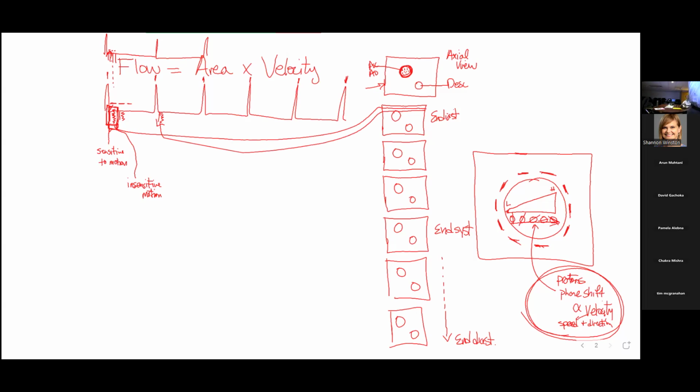The same principle, you know, to get the next frame, this comes over here. If we have another pair here, right? That goes here. So we're using the same principle that we used to make the cine images, but to make these velocity maps, in general, they're going to have less temporal resolution, right? They've got about half of what we had for previous.